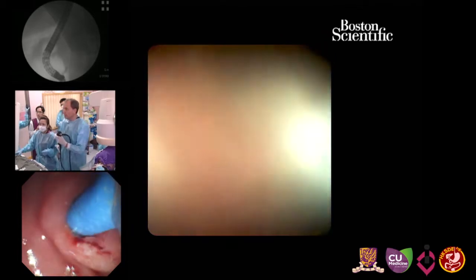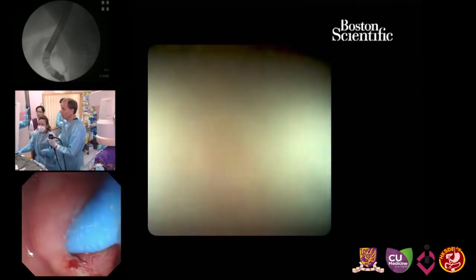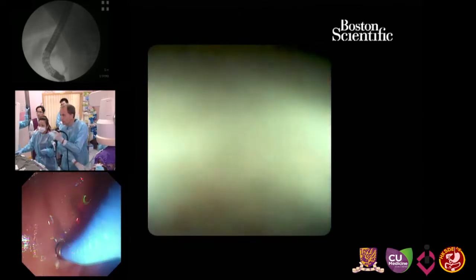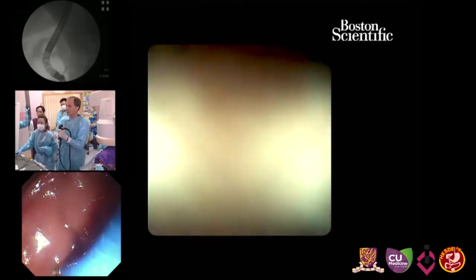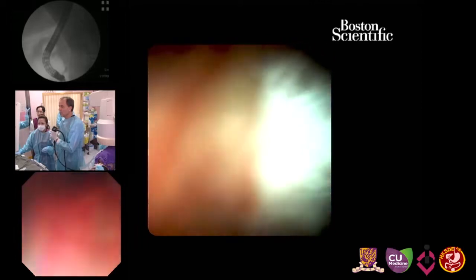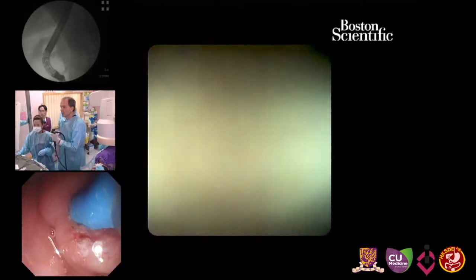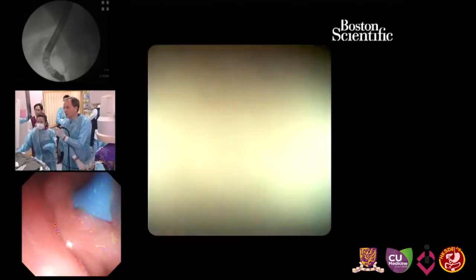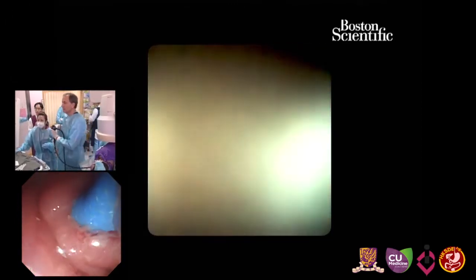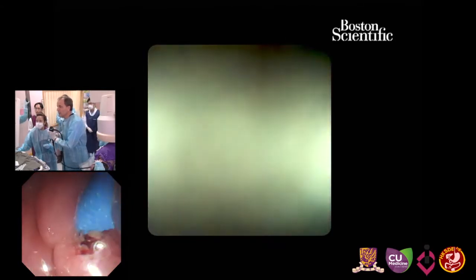And now I try to insert the SpyScope more deeply in the duct. We already saw the stone, but we cannot insert it over a wire because I had to preload it with a laser fiber. So I try to recannulate the duct now after dilatation. I was just in front of the stone, but then the patient moved again.